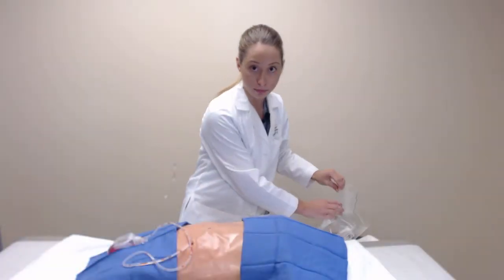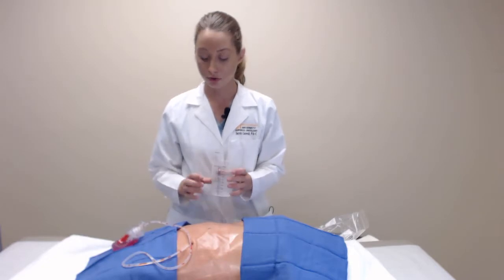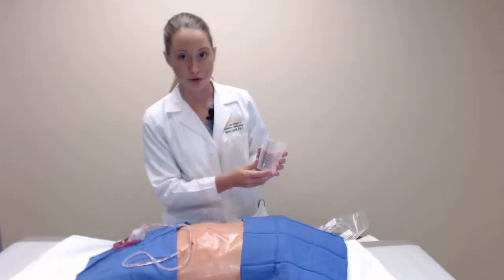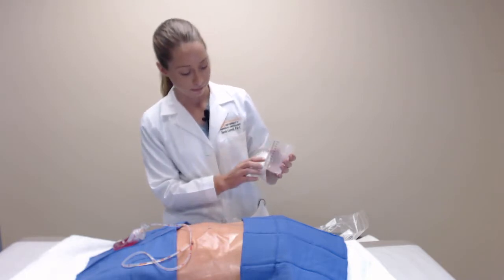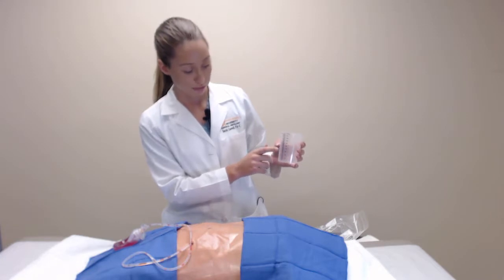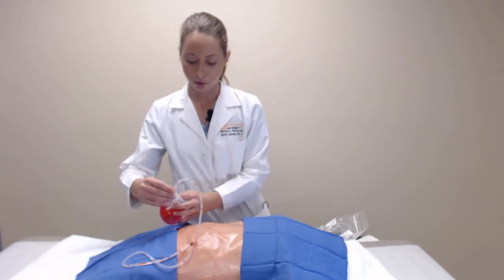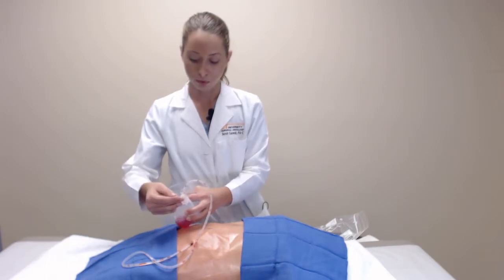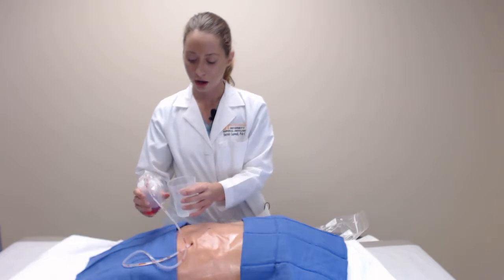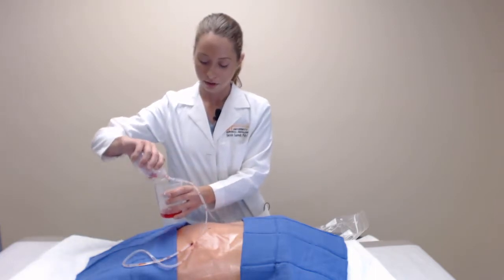So it's important to maintain a record of the output of your drain, and you'll measure the drain output every time you strip the drain. So to do so, you'll take your measuring cup that you received in your drain kit, and we'll use the milliliter side of the measuring cup to record your drain output. So to record your drain, you remove the stop top, you leave your tubing connected, and then you dump the contents of your drain into the cup.